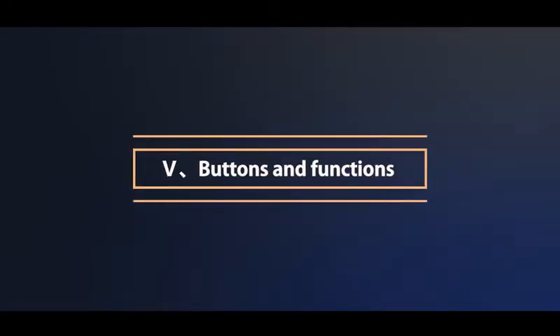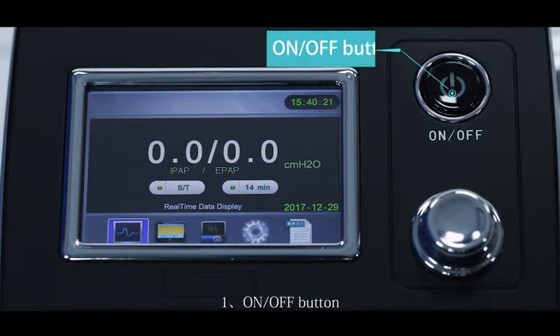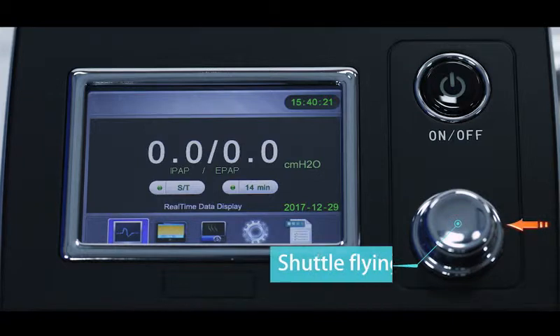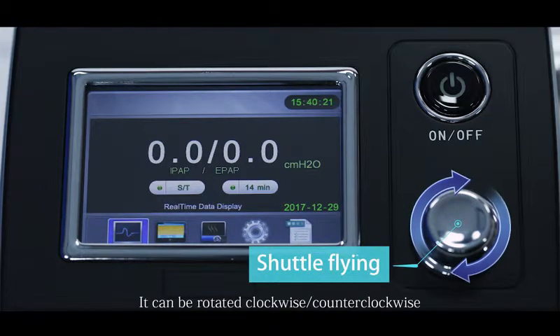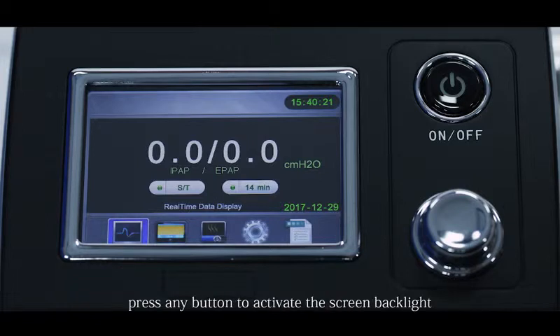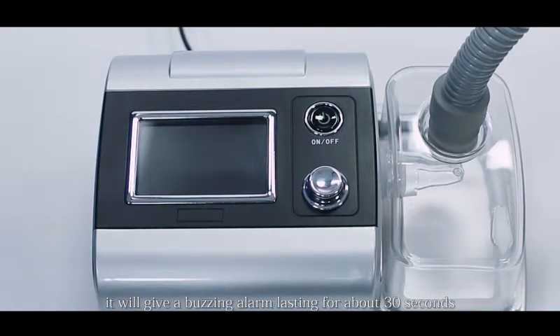Buttons and functions. There are two buttons on the host available for operation. The on/off button: after connecting with the power supply, the indicator light will be on. The shuttle button: it can be rotated clockwise or counterclockwise to adjust parameters. Press the shuttle button to confirm when the screen backlight is off; press any button to activate the screen backlight. Power outage alarm: when the device powers off in working state, it will give a buzzing alarm lasting about 30 seconds. During the alarm, press the on/off button or reconnect the power supply to stop the alarm and return to normal working status.